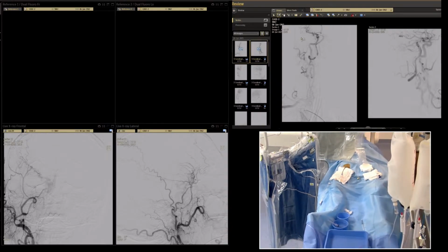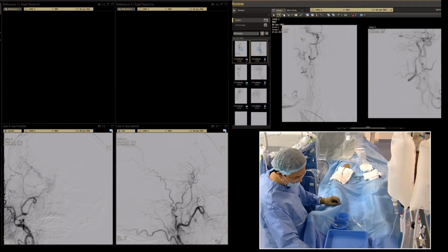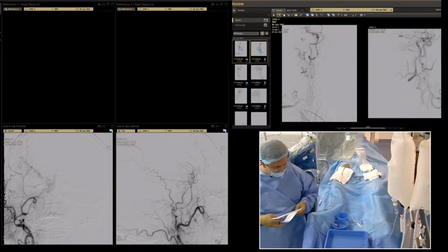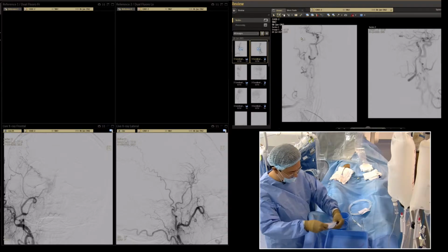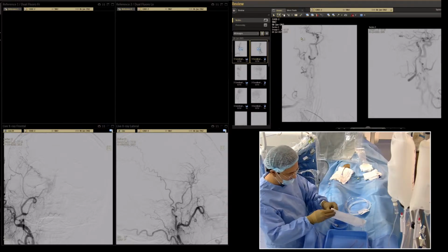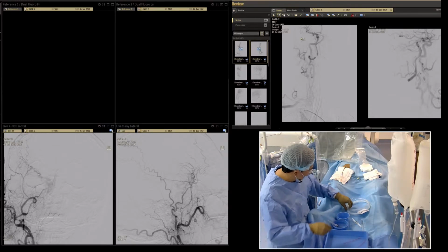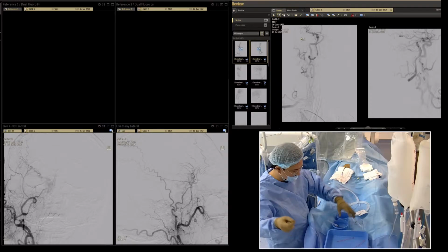Yes, in this 1.2 there is a hybrid in the package, and the second one with the additional abbreviation has no hybrid inside. Okay. Maybe we'll place Headway Duo also, but we'll see. That's why it's very important to check all territories.